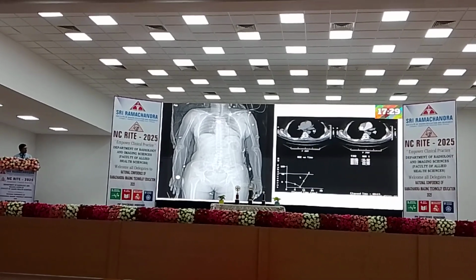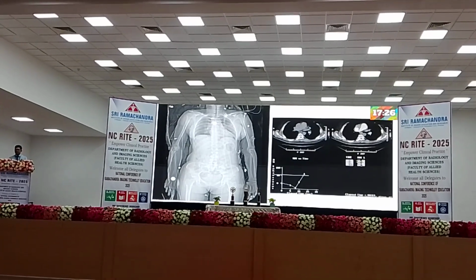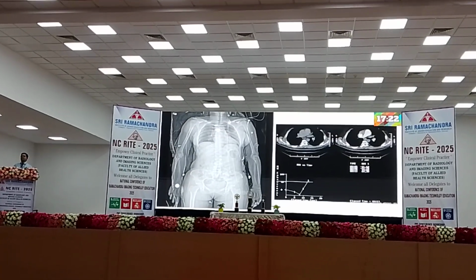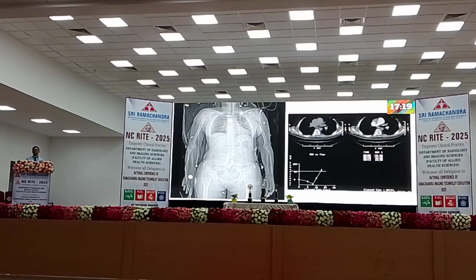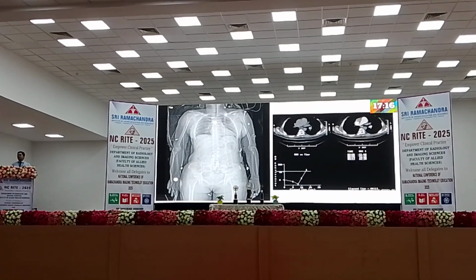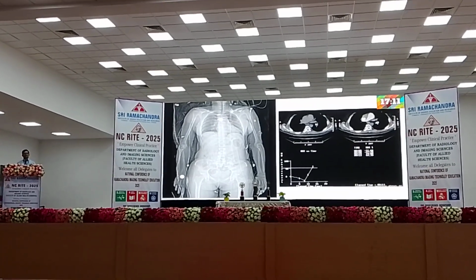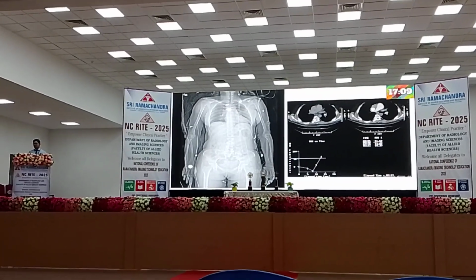And you can see the cross-sectional image of the chest, and there is a placement of ROI here. How many of you see? Can you lift your hand? I'm not going to ask a question, don't worry. Very few. It means you have not got a posting in CT? You might have got a posting in CT, maybe you have not observed.